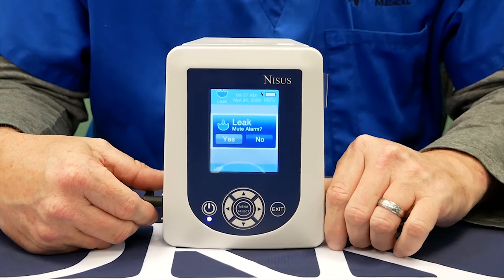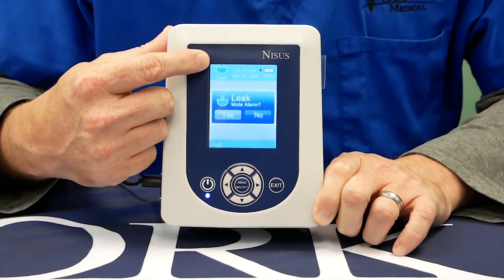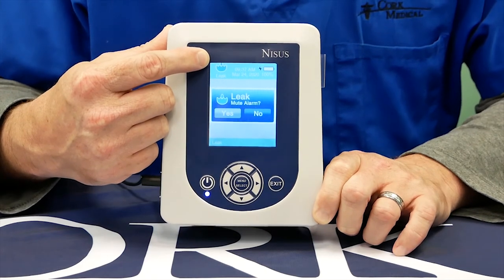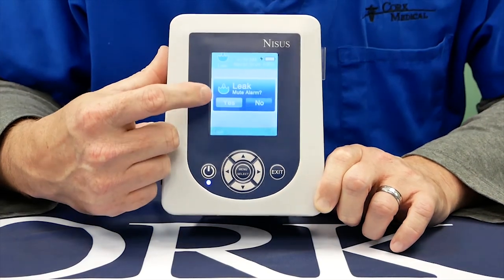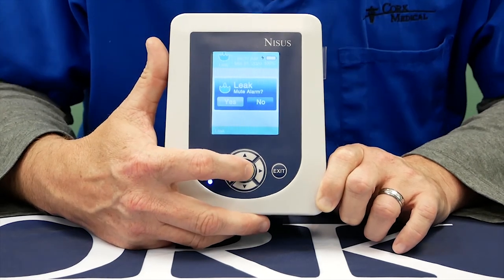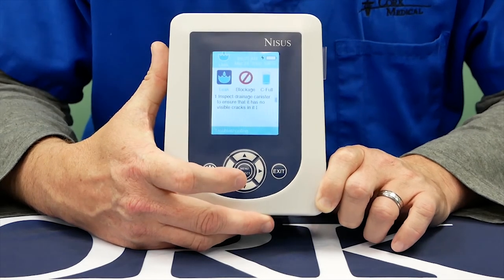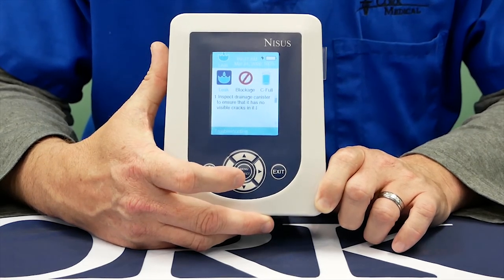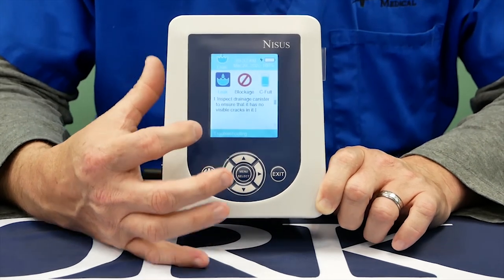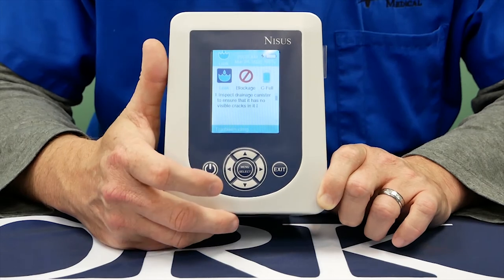One alarm that may occur during your therapy is a leak alarm. It will be displayed in the header and you'll see a leak icon, and the pump will also make an audible noise. At this point you have the option of muting it for five minutes. Press mute, and then a troubleshooting menu walks you through step by step how to fix the leak alarm.